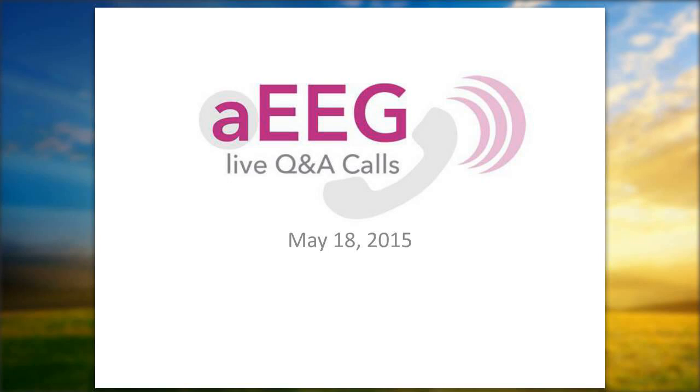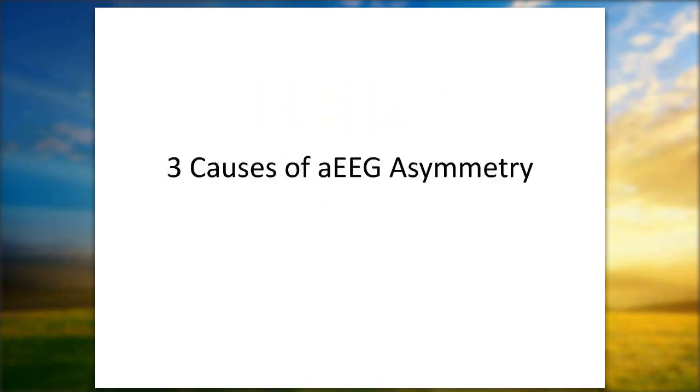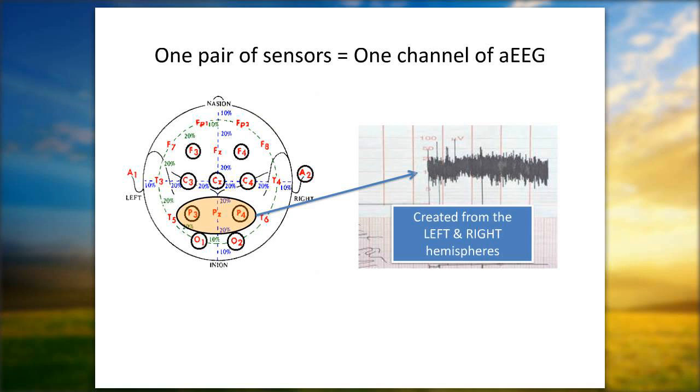I think your question is also what montage to use. I was always trained in the C3, P3, but I know that there are many people who do use the F3, P3 montage. The rationale for that, especially in preterm babies, is that you're going to see more surface area of the brain being monitored. Unfortunately, there isn't that much normative data for term babies, and even preterm babies, for the F3, P3. But let me see, I think I have a little slide here so we can all have a visual.